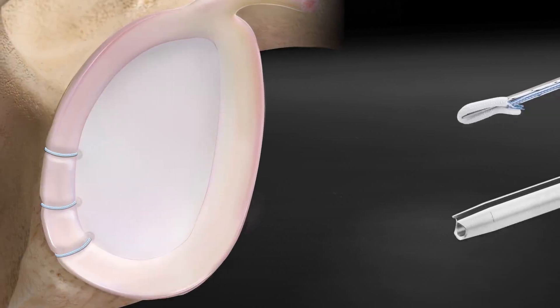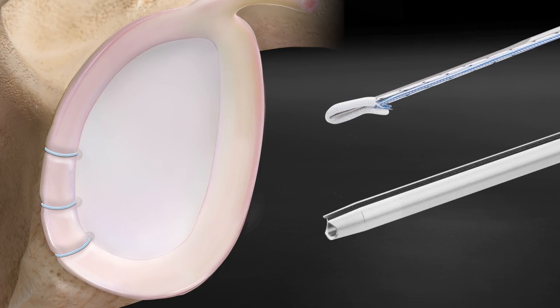Hi, my name is Dr. Mauricio Herrera and I am an orthopedic surgeon from Miami, Florida. Today we will be demonstrating the use of a percutaneously placed slotted guide to help insert multiple 1.8 knotless fiber tacks for a posterior instability repair.